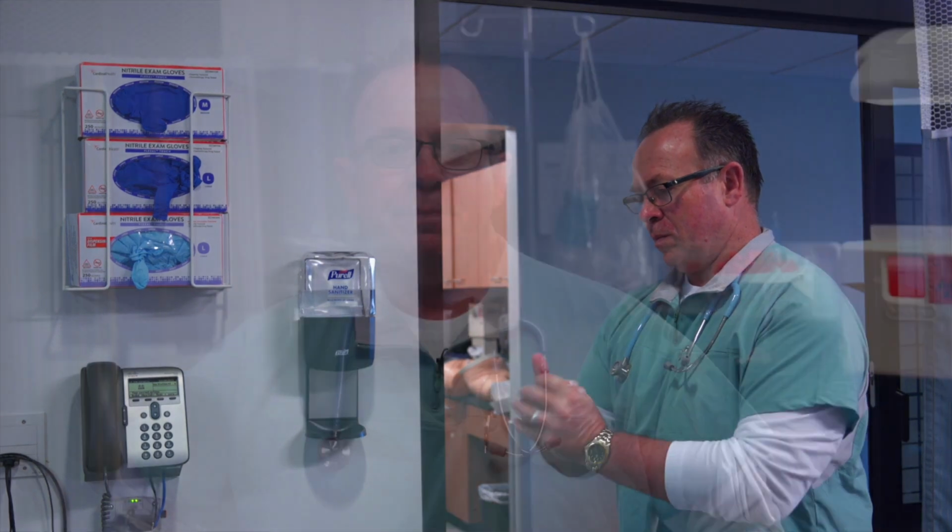Perform hand hygiene. For additional information on placement and care of indwelling catheters, please refer to your facility's policies and procedures and to your Foley tray insert, or contact your Cardinal Health sales representative.